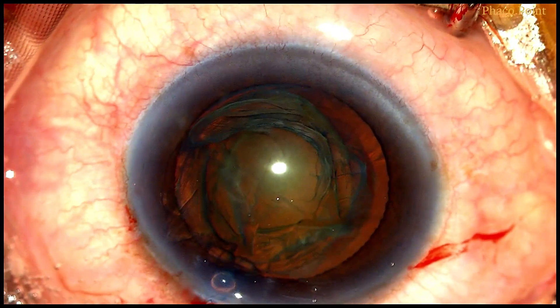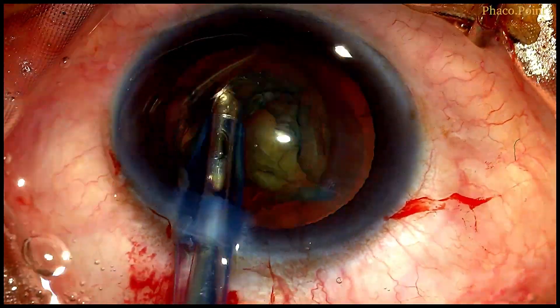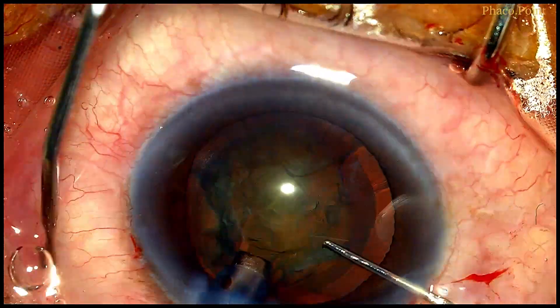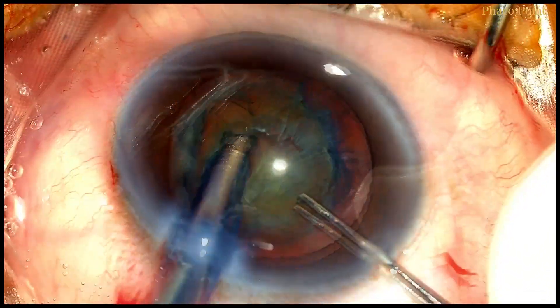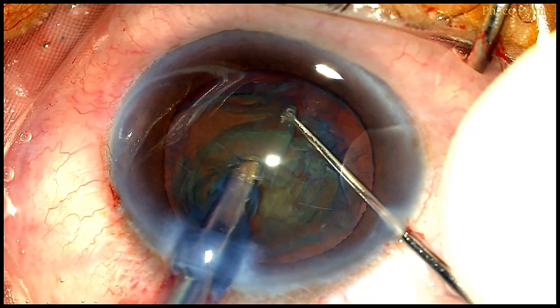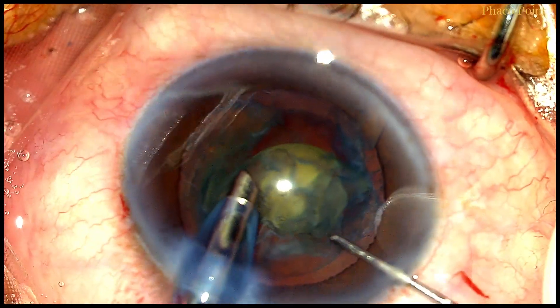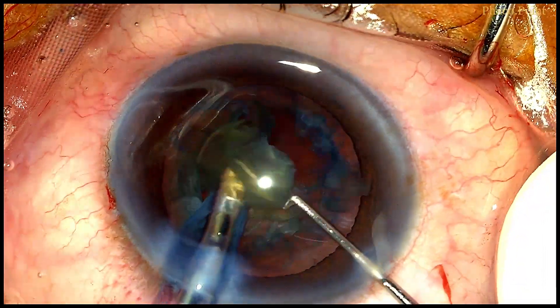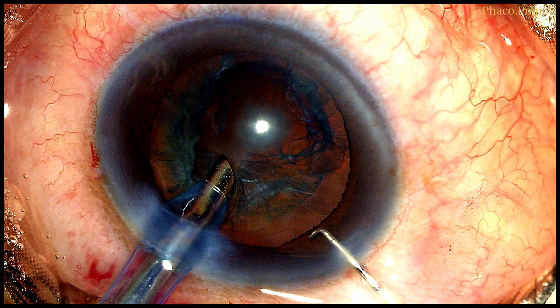We introduce some viscoelastic into the anterior chamber and are now ready to perform nucleus disassembly. With machine parameters set to low flow settings, the phaco probe and Szynski hook are introduced. For a soft cataract, I prefer to impale into the endonucleus with the phaco probe and lift it out of the bag, as this reduces lateral separation forces on the bag and better protects the posterior capsule.